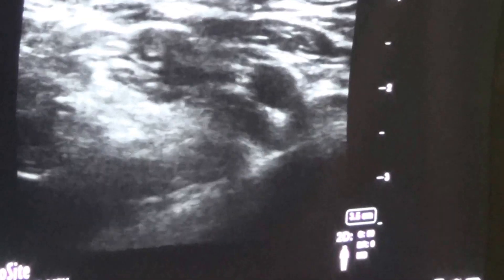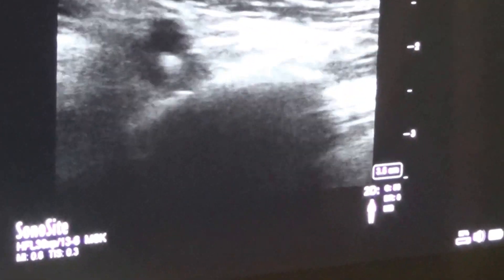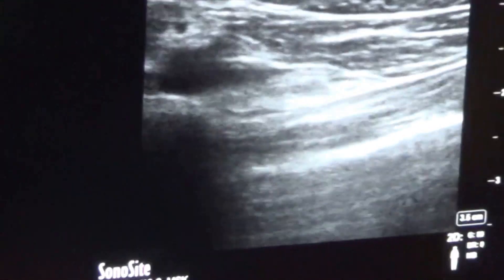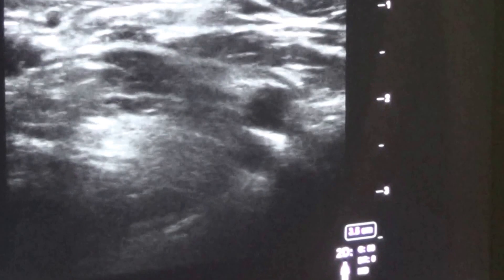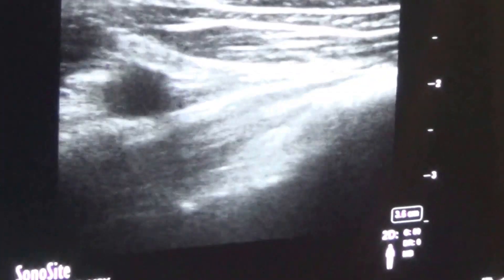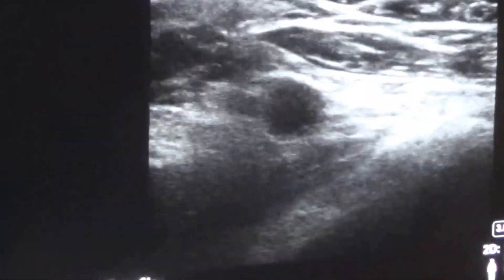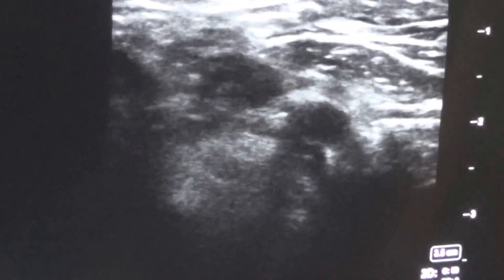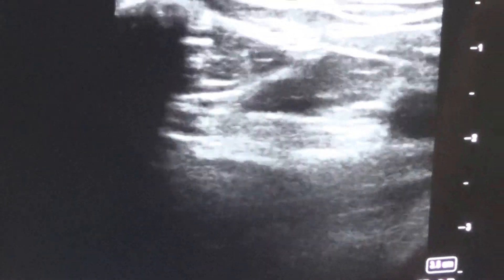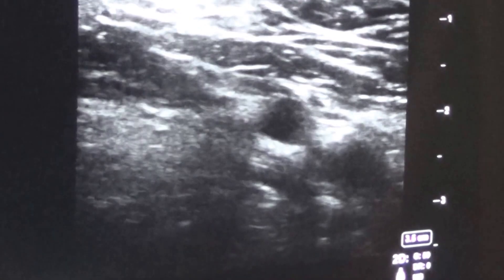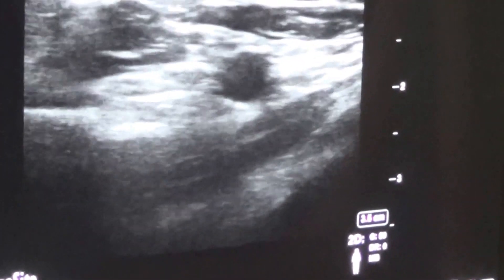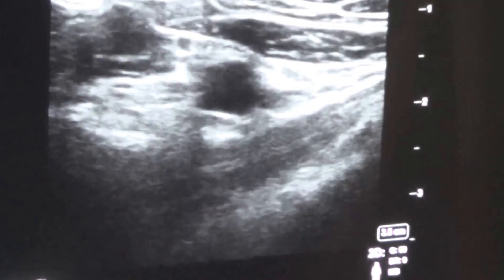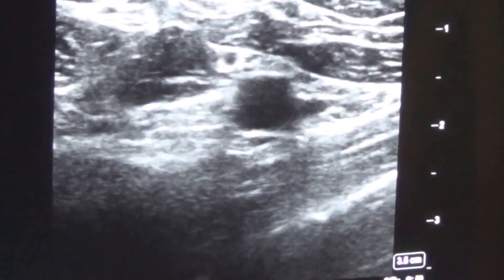This is the artery. Once you bring the artery, just release the pressure and look for the vein. Once the vein is in your view, you can proceed with subclavian CVP cannulation. You can bring the vein to the center of the screen — it may be in a collapsed state. Ask the patient to take a deep breath. You have to follow that vein for cannulation. We will discuss subclavian vein cannulation and infraclavicular nerve block in detail in a later video.